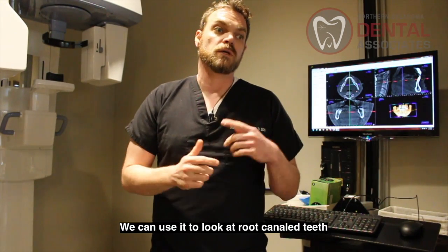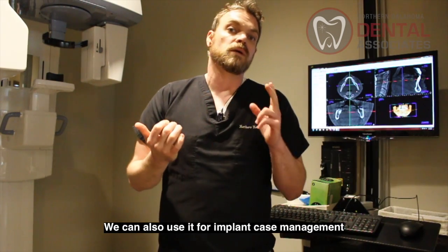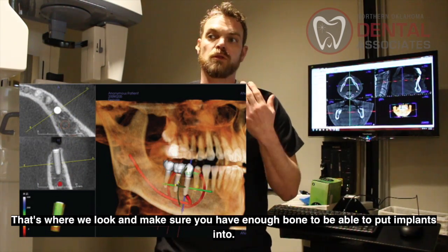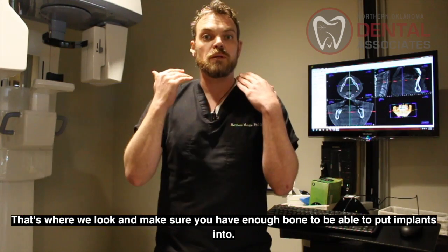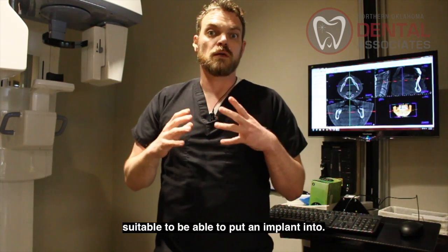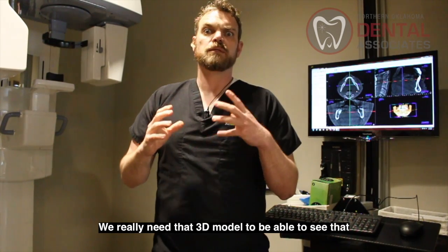Now we use this for a lot of different things. We can use it to look at root canal teeth to make sure that we got all the canals that are sealed up in it. We can also use it for implant case management, and that's where we look and make sure you have enough bone to be able to put implants into. We can make sure that the anatomy of the rest of your skull is good and suitable to be able to put an implant into. And we really need that 3D model to be able to see that.